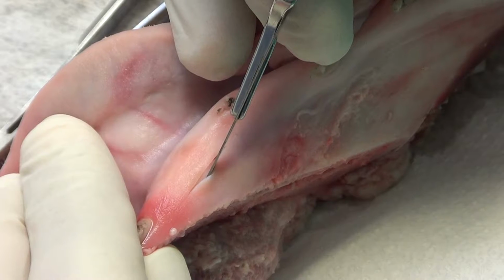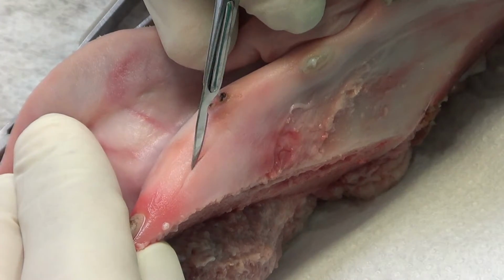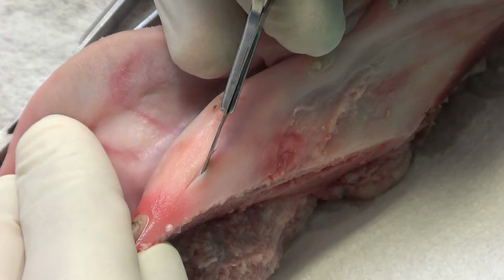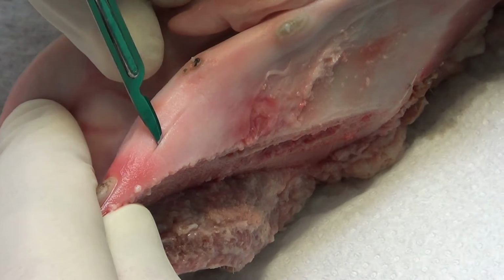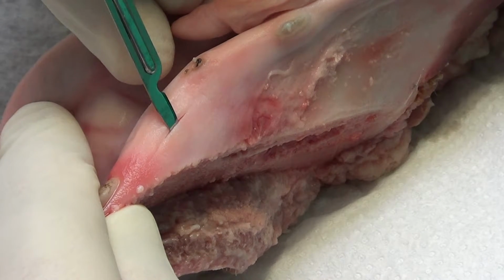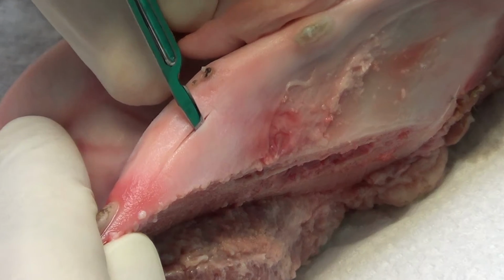Okay, look at the quantity of the soft tissue here, as I show you. It's 1.5 millimeters. So go deeply with the blade from mesial to distal, as you can do in the palate of your patient.